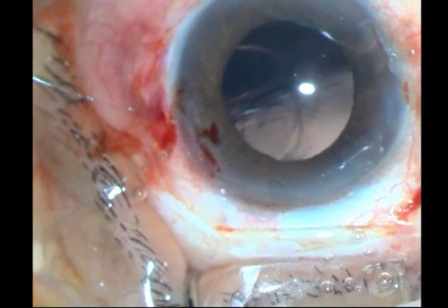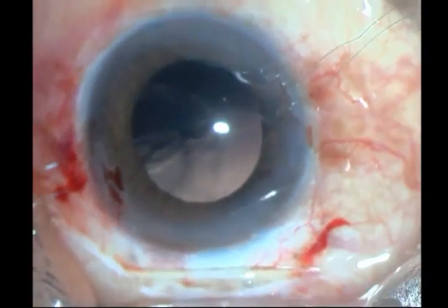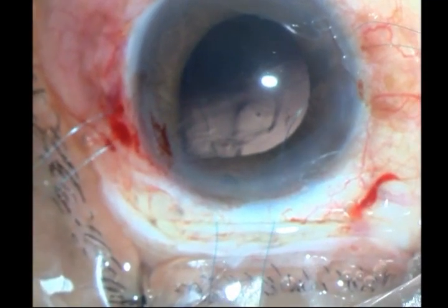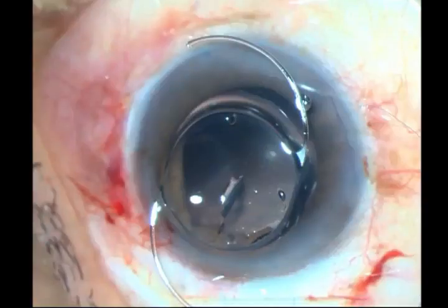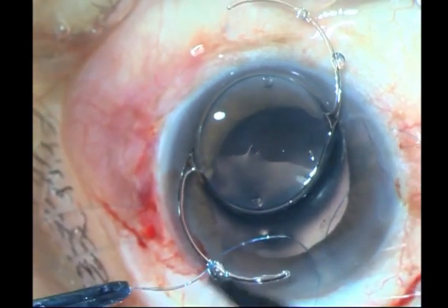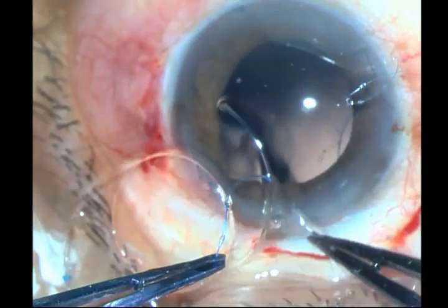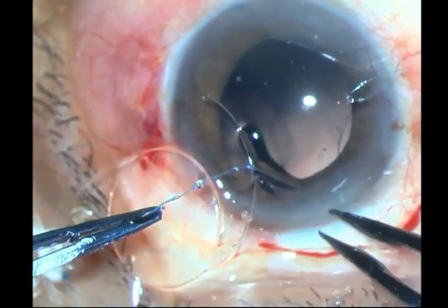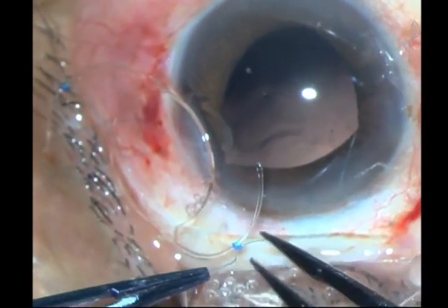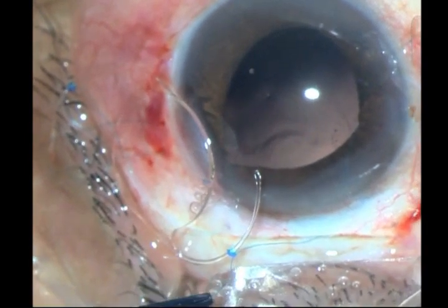Don't tangle your sutures — keep them apart. This 10-0 nylon is extremely difficult to handle. Nowadays we use 9-0 nylon, but this case was done more than ten years ago when we were using only 10-0 nylon. Here I am tying off the haptics. This is heavily edited — it is so difficult to tie the haptics with these sutures. I place about seven or eight knots, which I usually do. Trimming that bit.